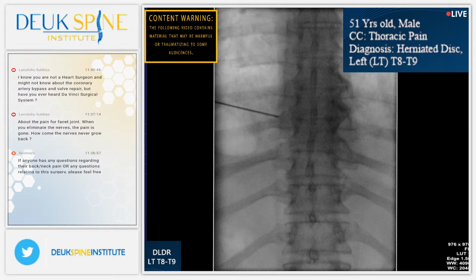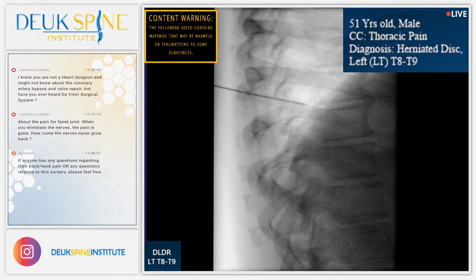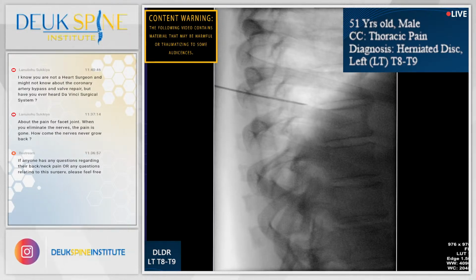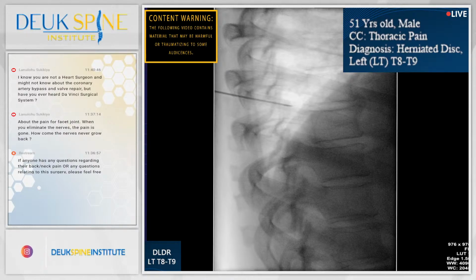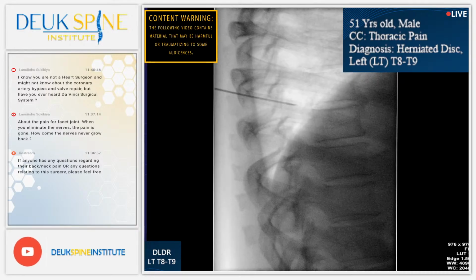All right, we're still pretty far off. Let's see where we are on lateral view. So we're still off on orbit. I wonder if you can fix the orbit. I've got to have an accurate orbital picture. Other way. A little more. I don't know. Seems like we went the opposite direction. What do you think? More better? I don't know, I'm not convinced. I think we're still off.